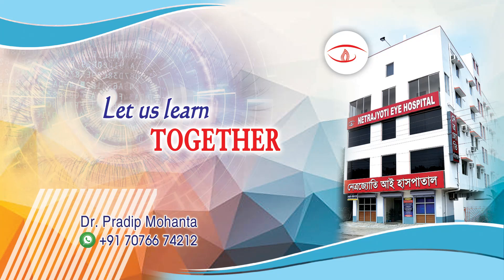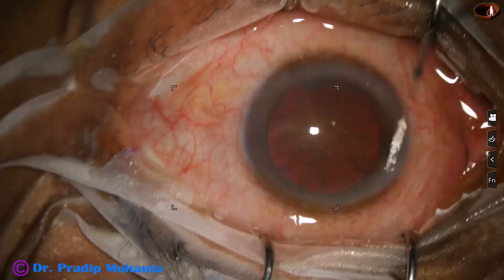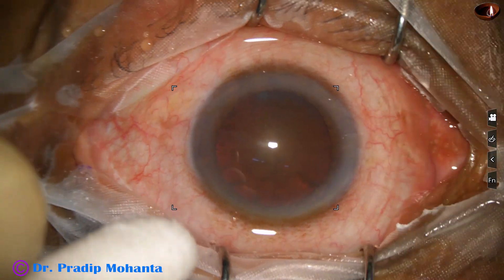Friends, welcome to my workplace at Rana Ghat, West Bengal, India. Let us observe this phaco surgery under topical anesthesia.